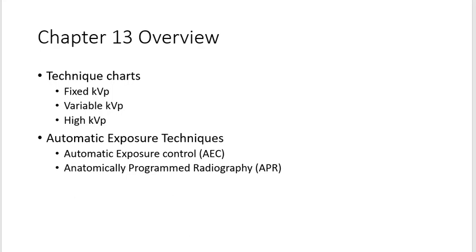And then we've got high kVp charts, and those charts are where we're doing specialty type exposures like barium work.